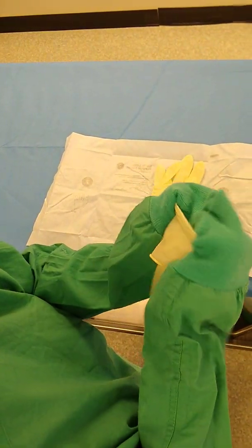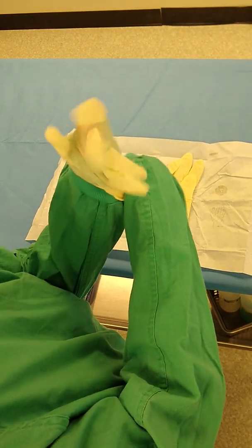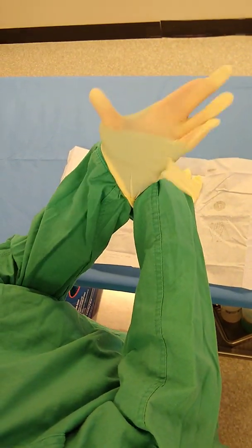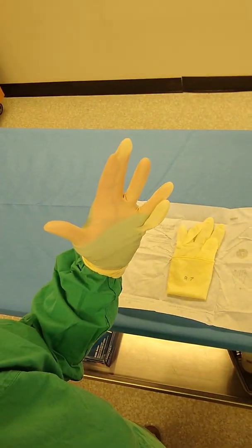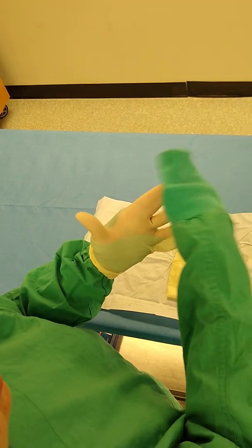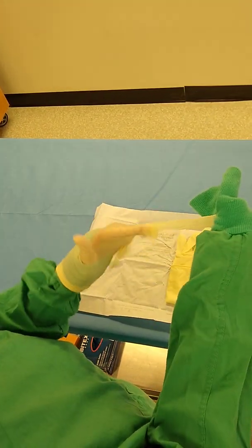Now this takes a little bit of wiggling. Now if you look, I have now put my fingers in the wrong spaces. This is not a time to panic - all you have to do is bring things over the right way.